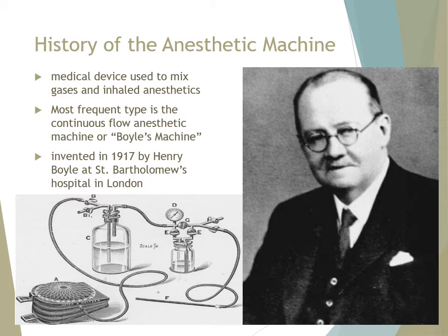So in 1917, si Henry Boyle, he is of course an anesthesiologist, developed the continuous flow anesthetic machine, or they call it the Boyle's machine. So this is very important because that helped revolutionize the way that we anesthetize our patients.